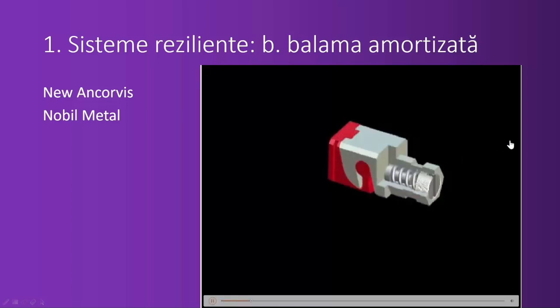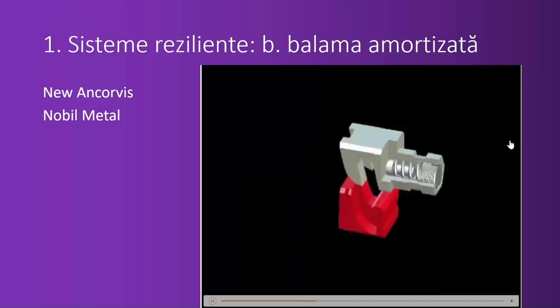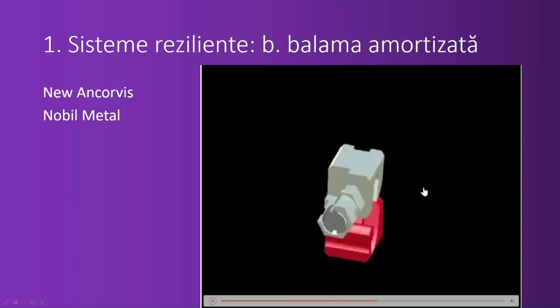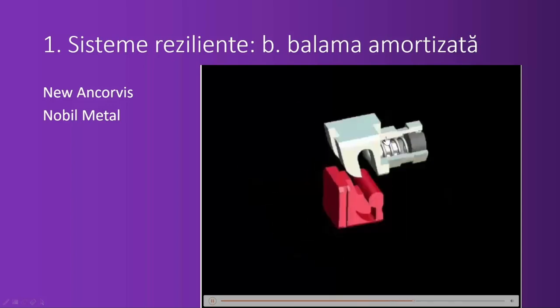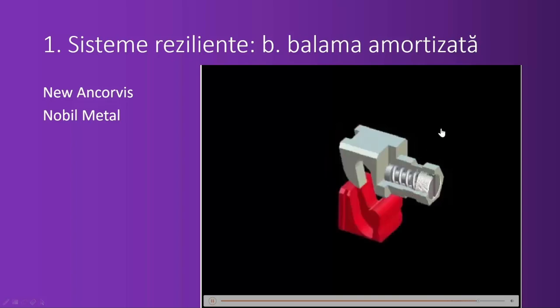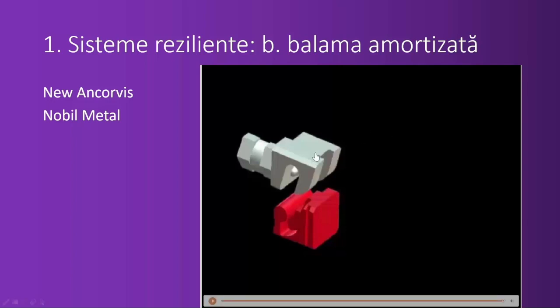It only allows the distal sinking of the saddle, and that's what it has been conceived for, uniterminal solutions. So you see, this is the spring. You can activate it. You see, it has a screw behind, and you can activate it or deactivate it, deciding how much force the patient will feel when inserting or disinserting this unilateral saddle. That's for unilateral saddles.